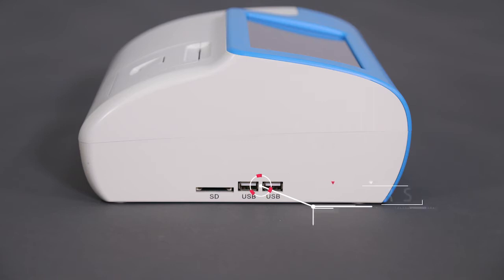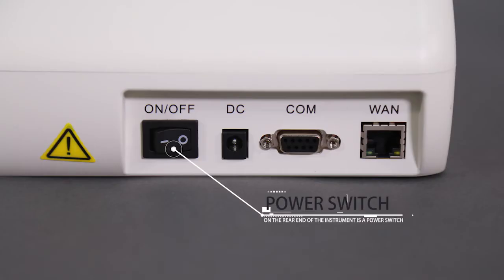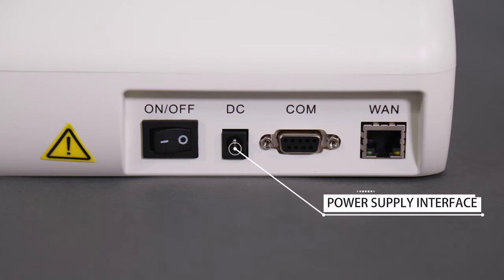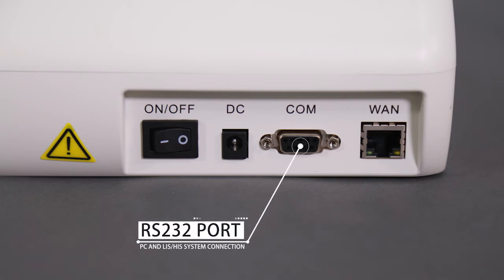Two USB ports on the left side are used to upgrade the system and to connect with an optional barcode scanner. On the rear end of the instrument is a power switch, a power supply interface, an Ethernet port, and an RS232 port for PC and LIS-HIS system connection.